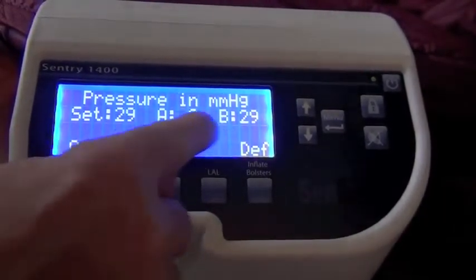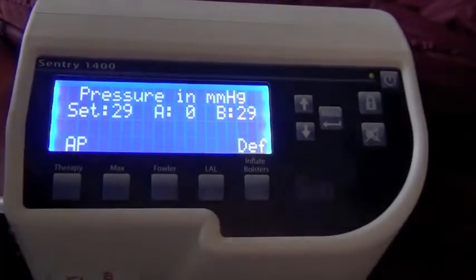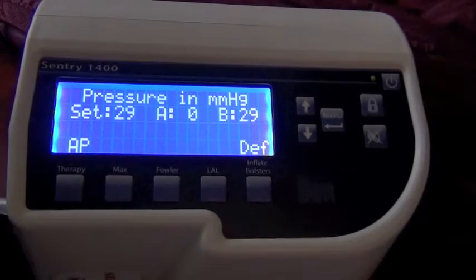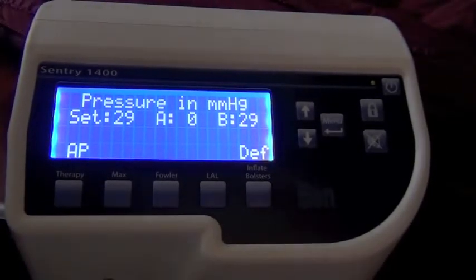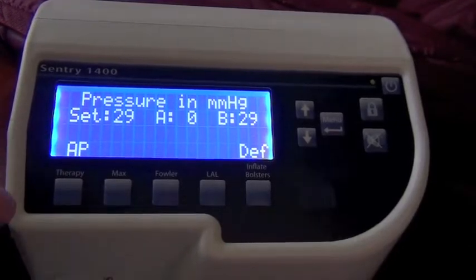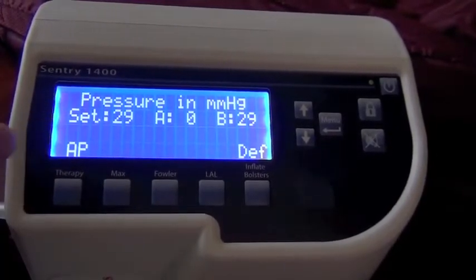So what we're actually doing here is offloading tissue that is suspended over those A cells or A air pillows that run side to side on the mattress. That's the beauty of alternating pressure therapy. This occurs every 5 minutes on this system. So every 5 minutes we're switching from A to B.